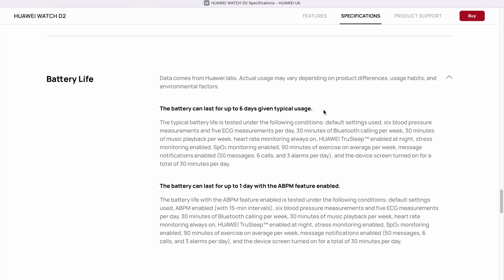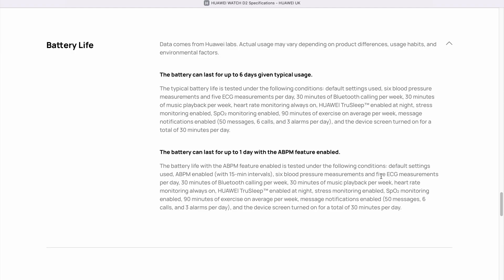Finally, let's talk about battery life. The Huawei Watch D2 lasts up to 6 days with typical usage. Huawei specifies the exact conditions: 6 blood pressure measurements per day, 30 minutes of calls per week, and an average of 90 minutes of activity recording per week. I personally record significantly more activity — around 90 minutes per day — and during my testing I measured blood pressure way more than 6 times a day. For me, the watch lasted around 4 to 5 days, which is still more than acceptable and outperforms most other smartwatches. If you activate the 24-hour automatic blood pressure measurement every 15 minutes, the battery life is reduced to only about one day — but that's a trade-off you'll likely be willing to accept if you rely on regular blood pressure measurements.